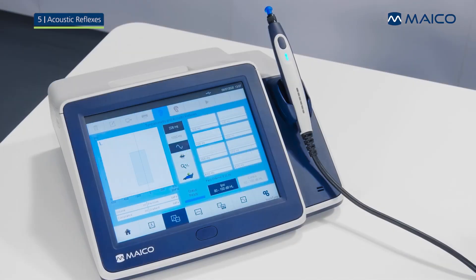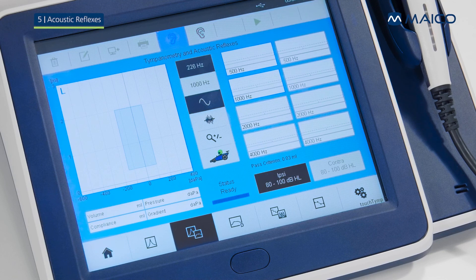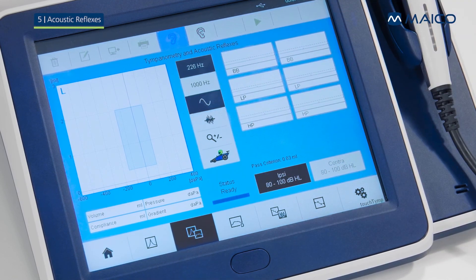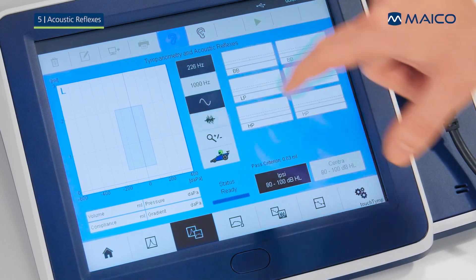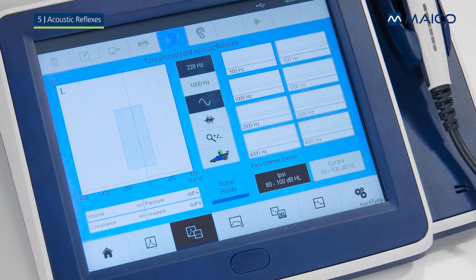Before performing measurements of the acoustic reflex, a tympanometry is performed to find the maximum compliance pressure for better performance. Depending on your device configuration, you can measure ipsilateral and/or contralateral reflexes with various pure tone or noise stimuli. Before measuring, select or deselect your preferred stimuli, or fine-tune your default selections within the settings.